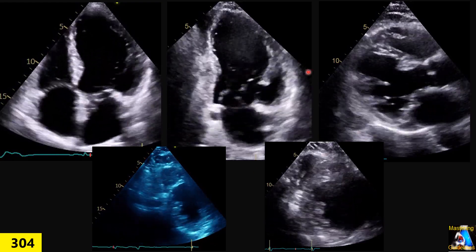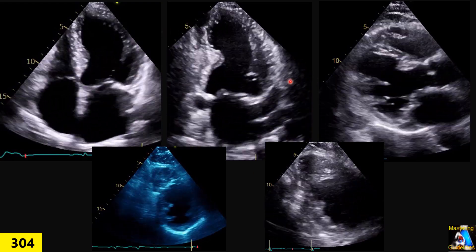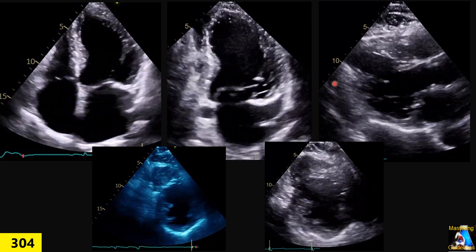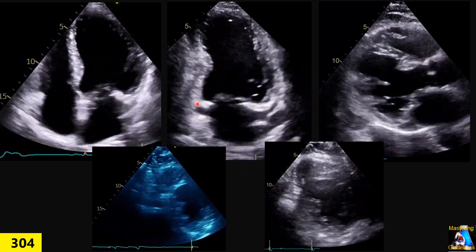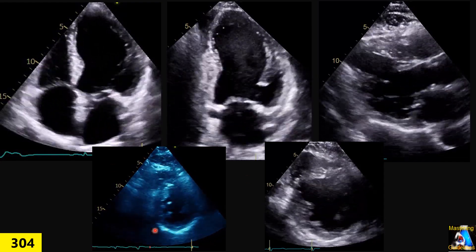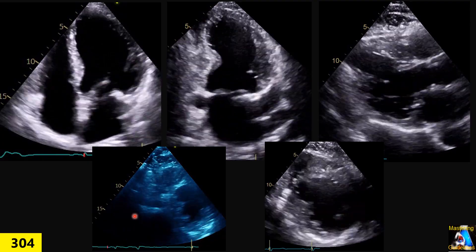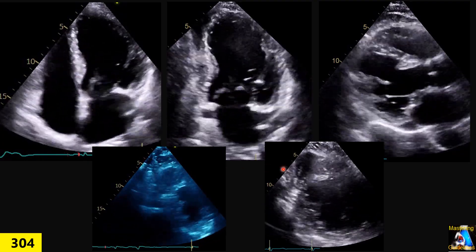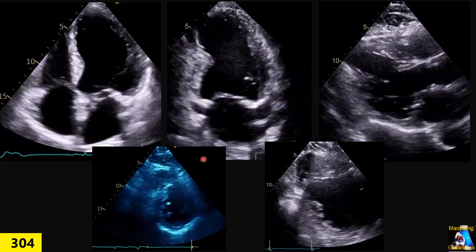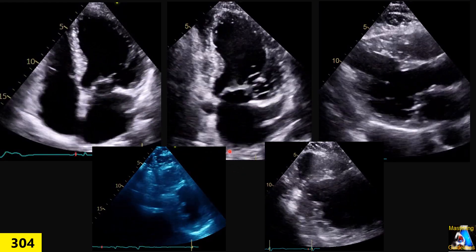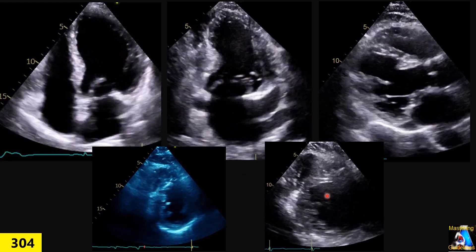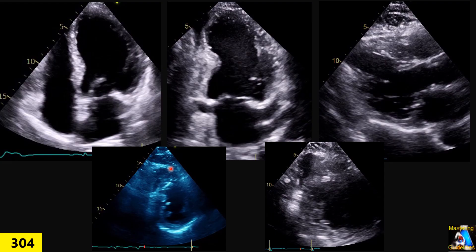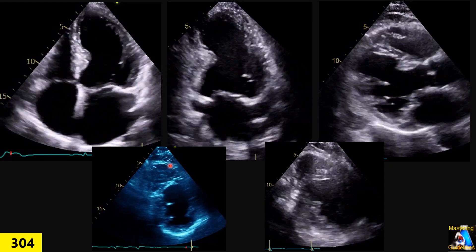We did the test — an ECHO was performed — and we got these five clips, as you can see. On the report, it mentioned the patient has cardiomyopathy. Based on this, what do you think? Does the patient have cardiomyopathy or something else?